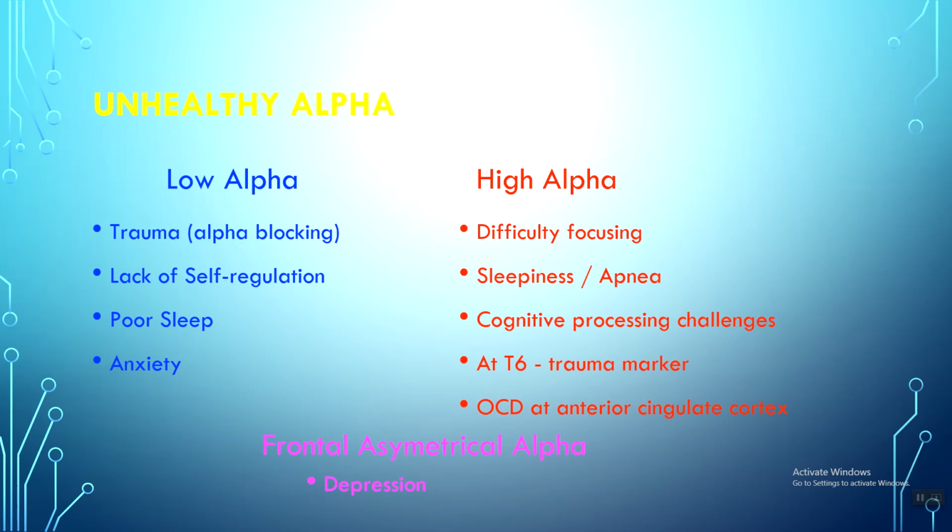If someone starts to fall asleep within 1 minute, which starts with high amplitude alpha and then alpha goes away, then they probably have apnea. Or if they have a lot of eyes open alpha, they also may have a sleeping disorder, and it's their system saying, I'm exhausted and I just want to fall asleep.